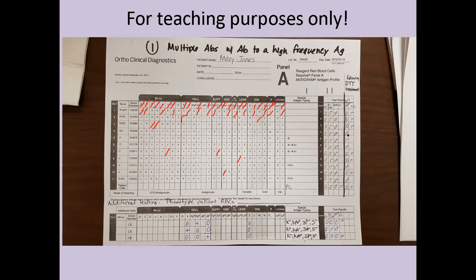It reacted more strongly with 4 than with 5 or 6. So let's take a look at that. When we look at cell 4, we see S antigen is there without little s, so it's homozygous expression, whereas cells 5 and 6, the little s is there too, heterozygous, weaker expression of that S antigen, and that could be why we see these varying reaction strengths.